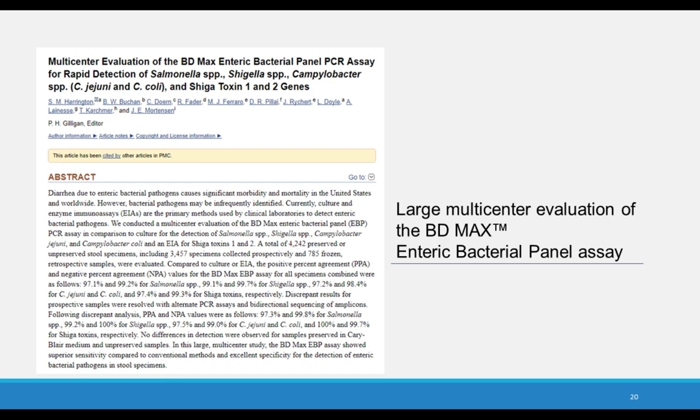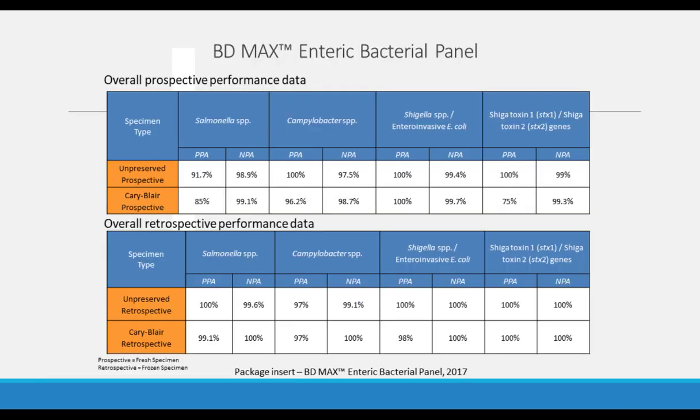It's a very large multi-center evaluation with thousands of specimens, and I think if you want to read more about how they went about doing their testing and their findings, this is a very good reference for you to go to. I might just address some of the overall performance data in these charts just to let you see how robust this assay really is.